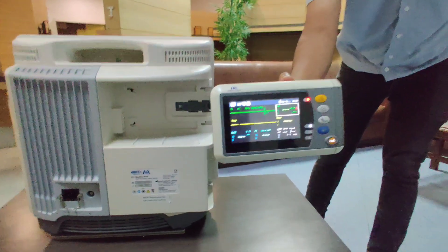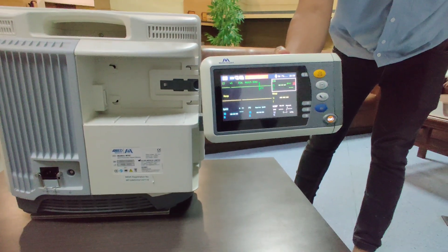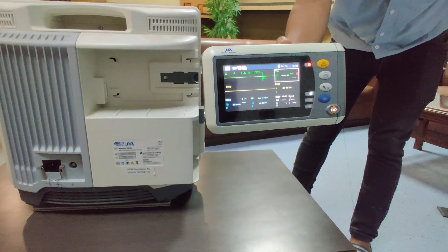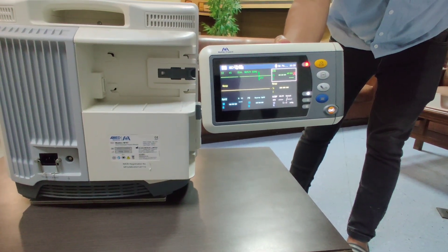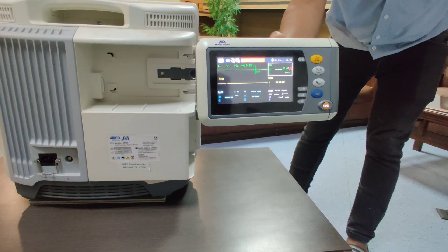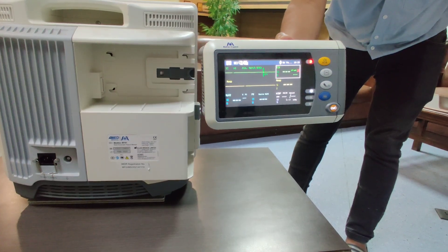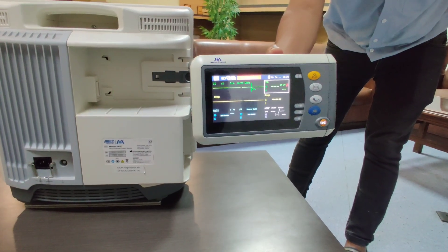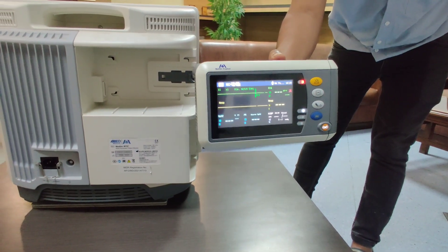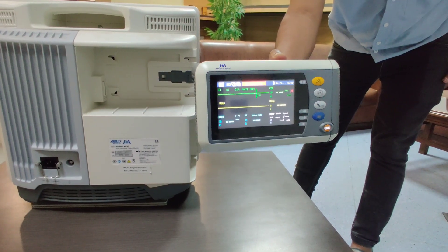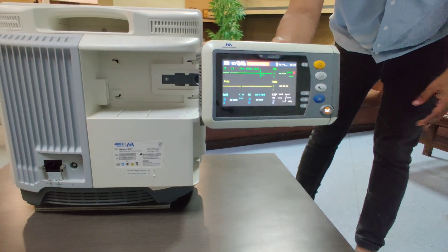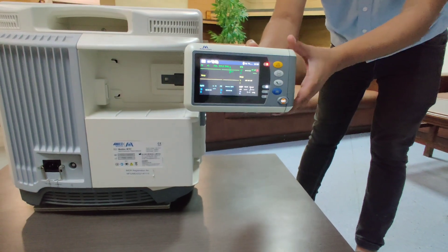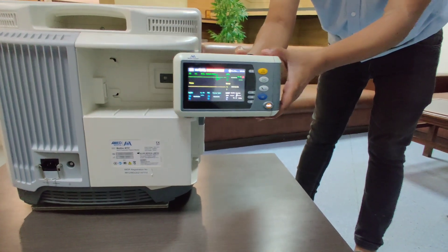This small monitor can be used for transporting the patient within the hospital or outside the hospital. It has all the connectors on the side.